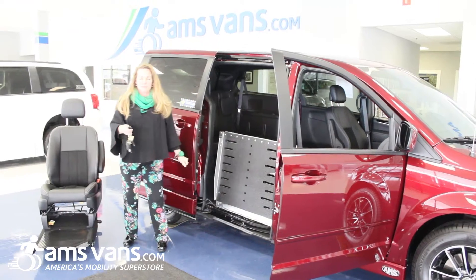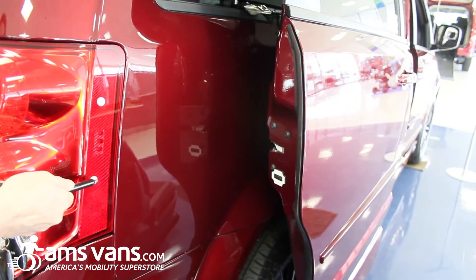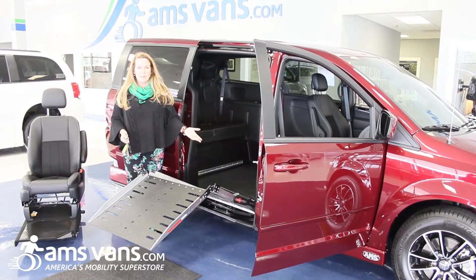The ramp can be deployed a few different ways. I'm using the remote. We also have magnets on the side or on the inside of the door — press a button. It's a bi-fold power ramp.